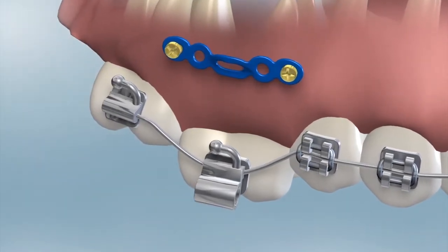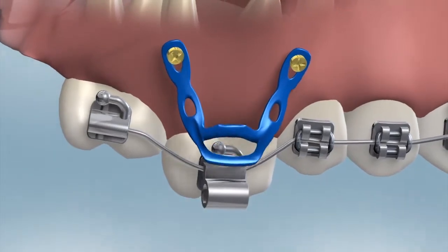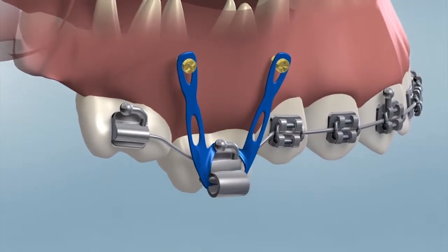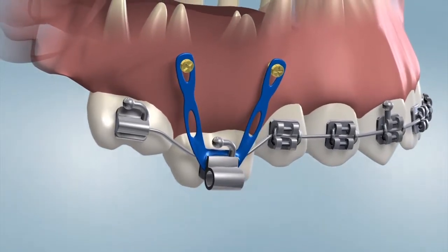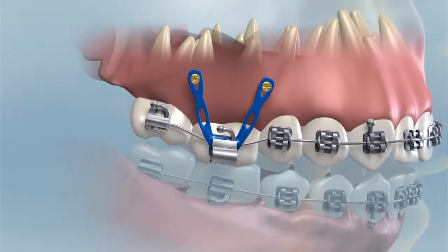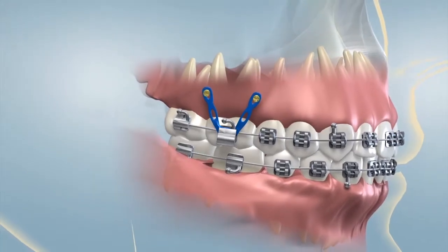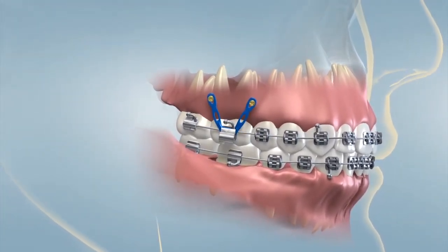The benefit of a TAD is based on the basic law of physics. We know that for every action, there's an equal and opposite reaction. In the mouth, when we put a spring or rubber bands between the teeth, they both will tend to move. The ability for the teeth to move through bone over time is what allows us to move teeth with orthodontics. A TAD is placed so that the orthodontist can design a customized tooth-moving pressure system.